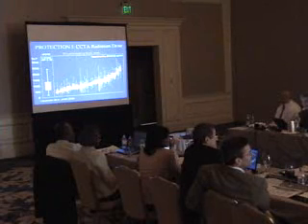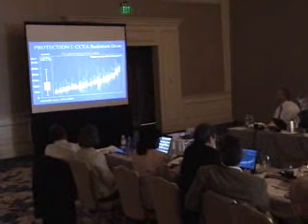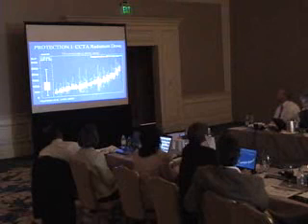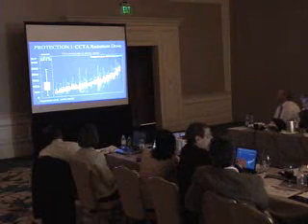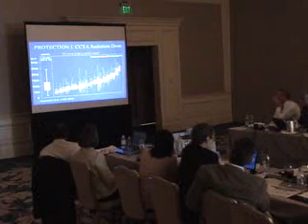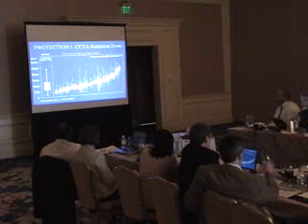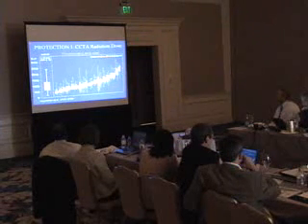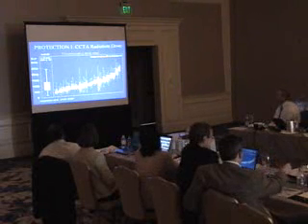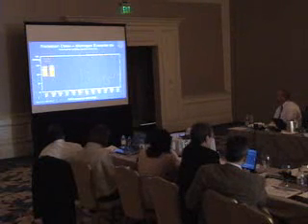So how much radiation is associated with these coronary CTA studies? This is a study widely recognized in JAMA from Hausleiter in 2009, showing that at that early time, coronary CTA really began around 2005, or early in the phase of the development of this procedure. Early on it had about a 12 millisievert radiation, but as shown on the right part of this slide are the variations across different sites. There was a marked variation from site to site in how much radiation was associated with coronary CTA.